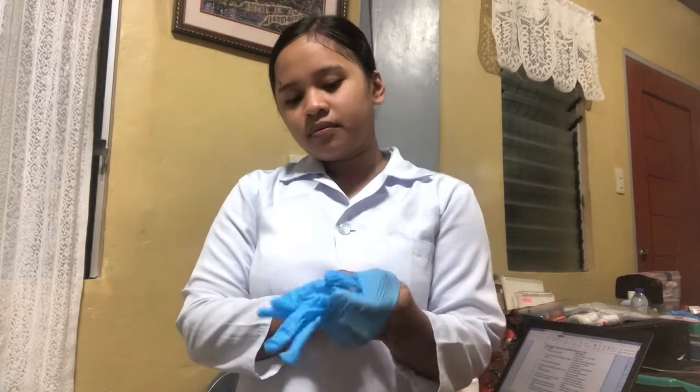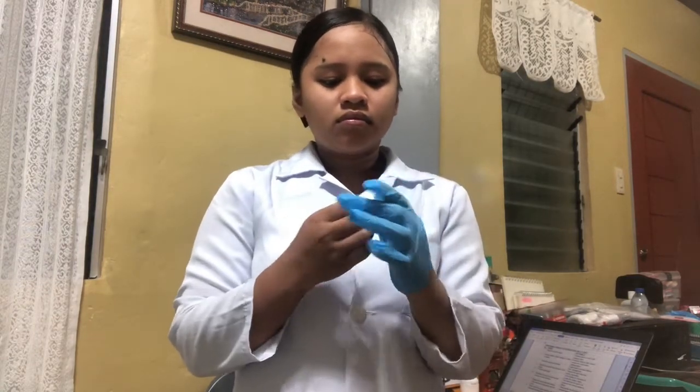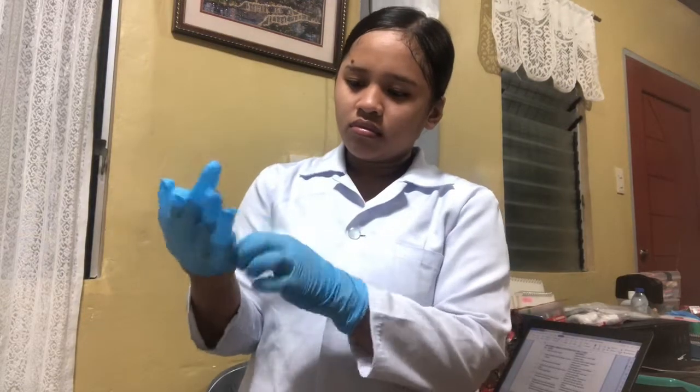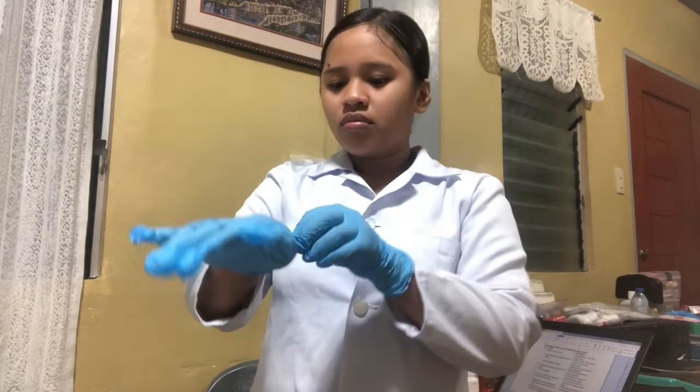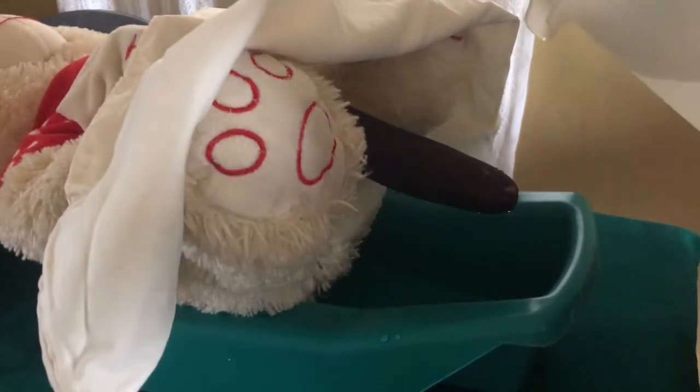Put on working gloves. Do perineal care or flushing.